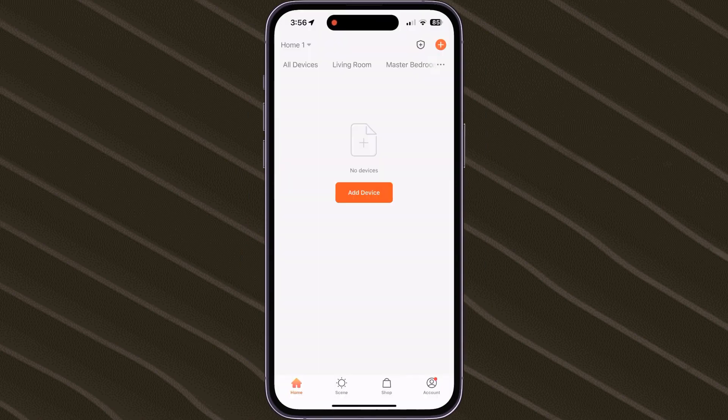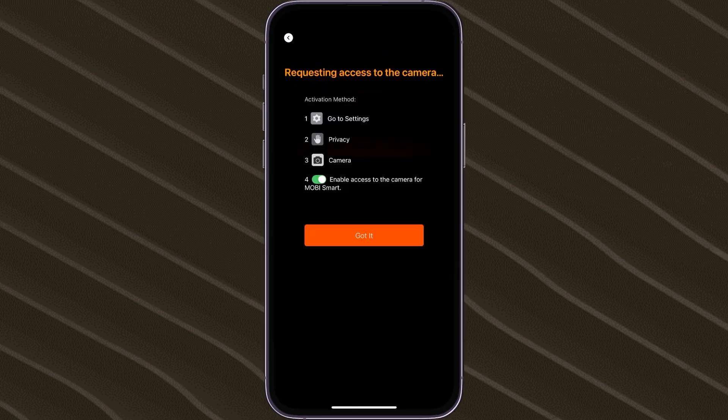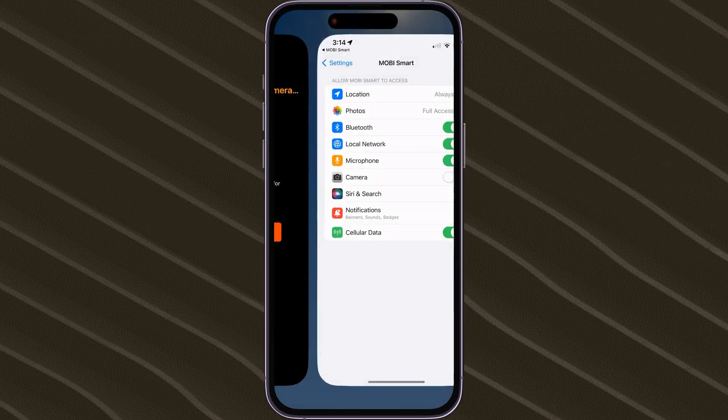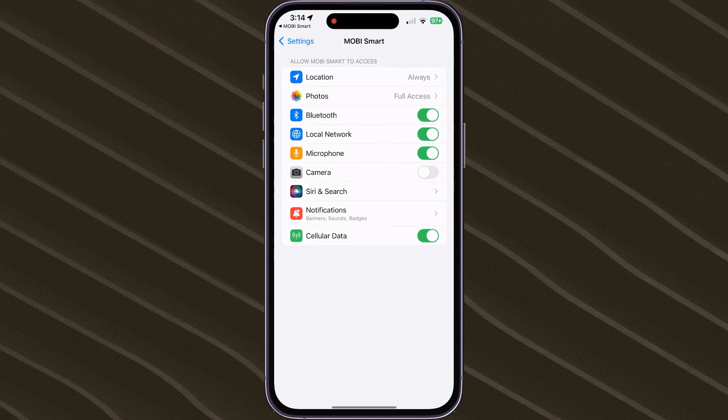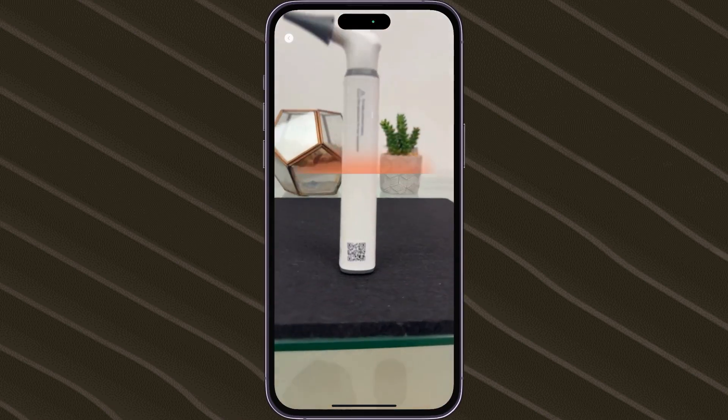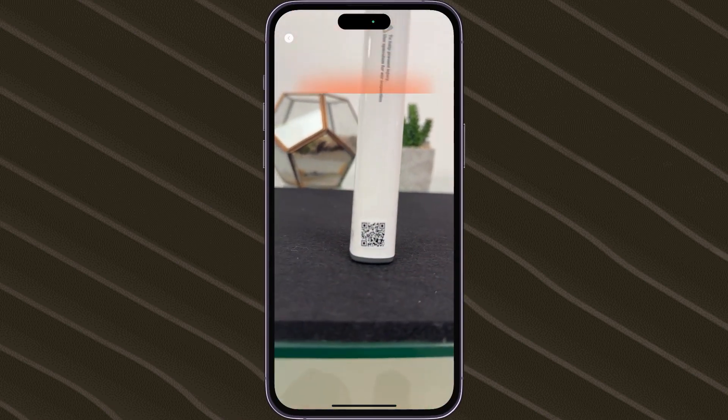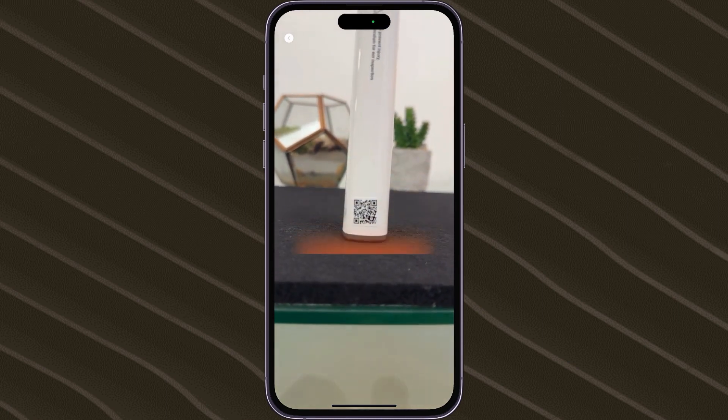On the main screen of the app, tap on the orange button with the white plus sign and tap on Scan. Please allow the Mobi Smart app to have access to the smartphone's camera. After doing so, point your smartphone's camera in front of the Otoscope's QR code.